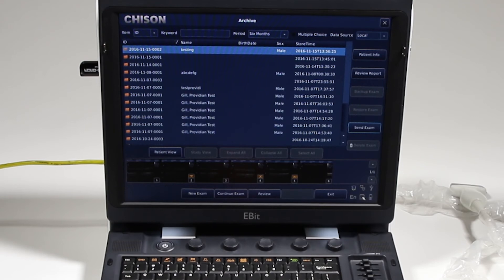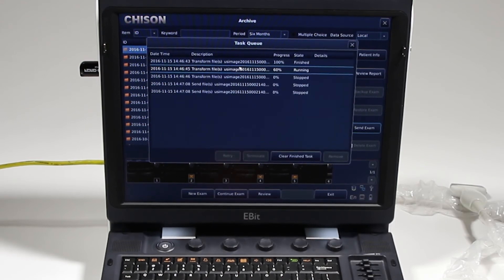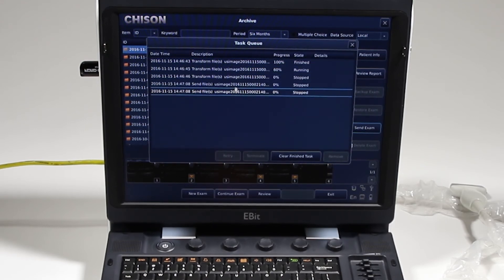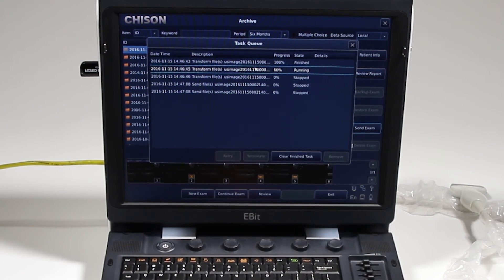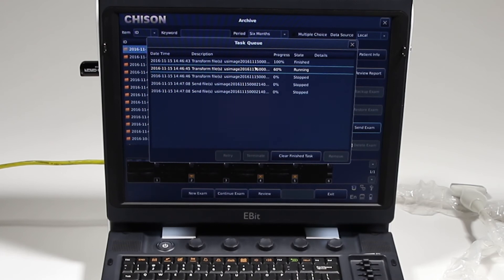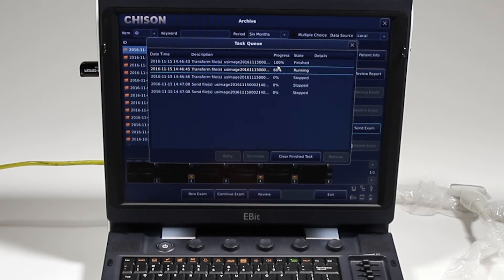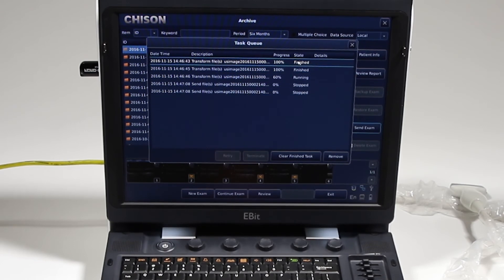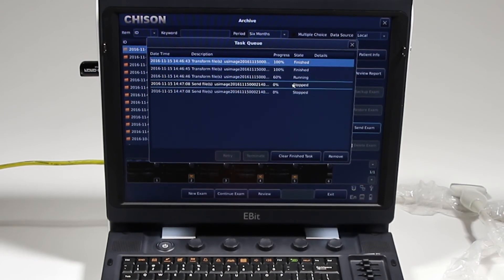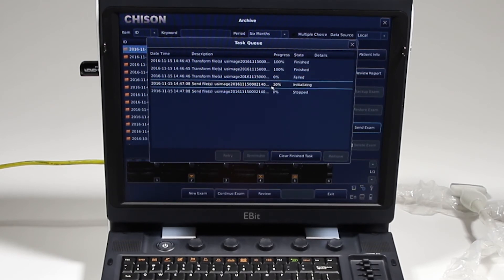My task manager is showing the images I'm sending over the DICOM network. It's telling you that it's running. First, it has to convert the image to the DICOM format, then it will send it over the network. This says the first one's over there, so it is set up on the DICOM server. The DICOM server said okay, I received it. If I want to remove that, I can clear it. I can terminate the task by clicking terminate, saying I don't want to send that.